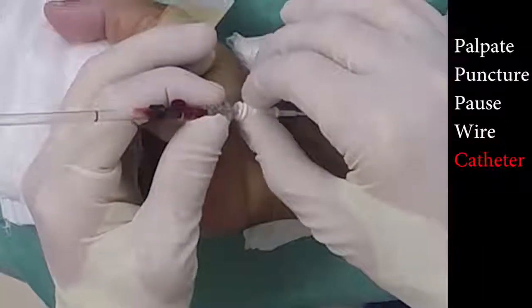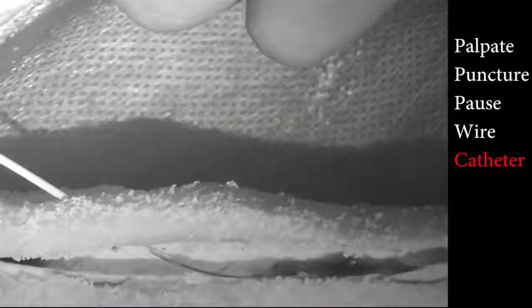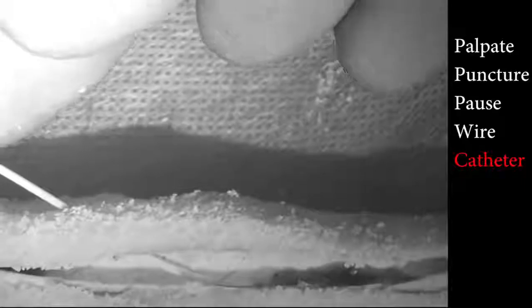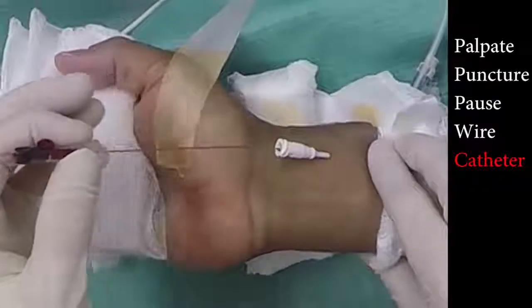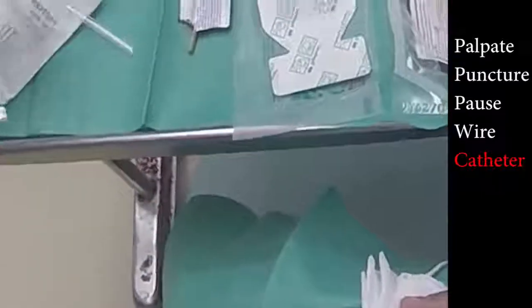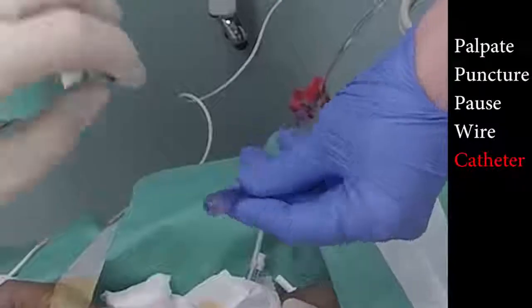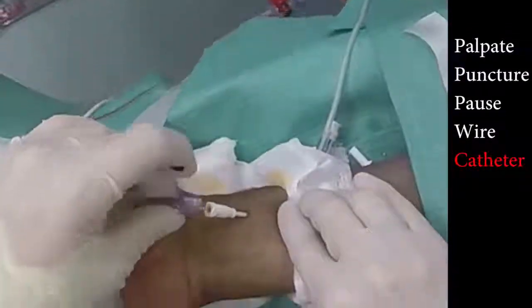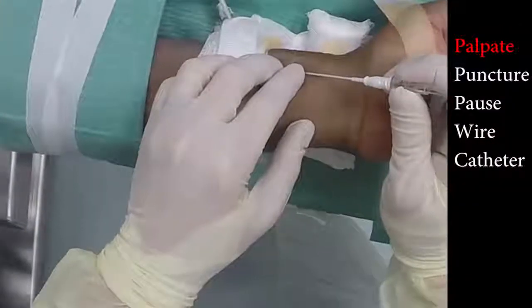Finally, we come to step 5. Using constant pressure or a twisting motion to overcome the resistance of the skin, place the catheter in the artery until you reach the hub. The Arrow introducer can now be retracted and discarded. Keeping pressure on the area just proximal to the tip of the catheter will prevent blood from leaking out once this is removed. This next clip will be played at full speed.